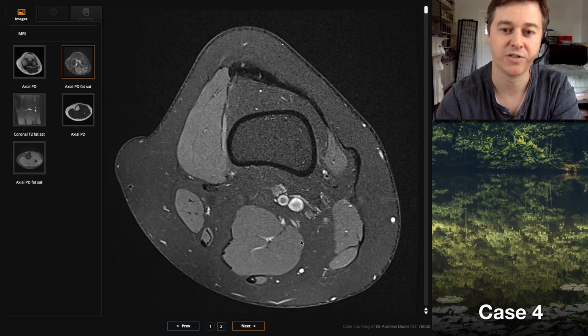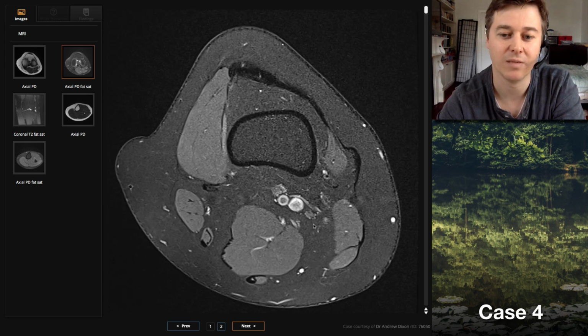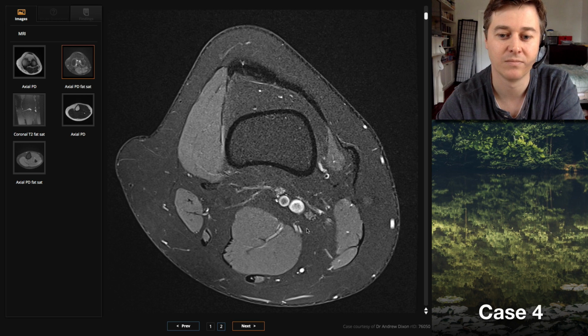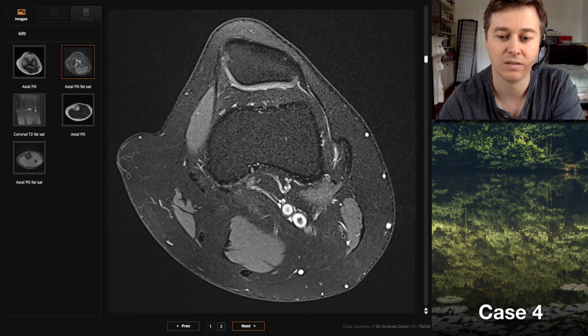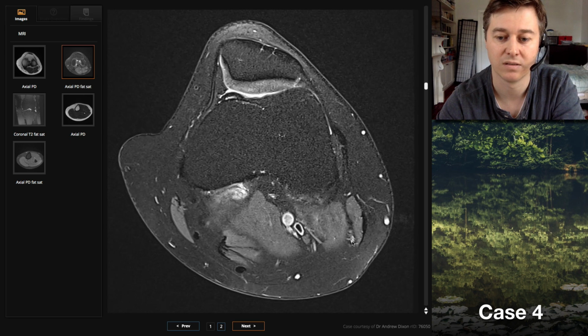And what anatomical structure do you want me to track in a patient with foot drop? I'd like to look at the common peroneal nerve from its origin down to the fibular head, because this is a common location for entrapment.